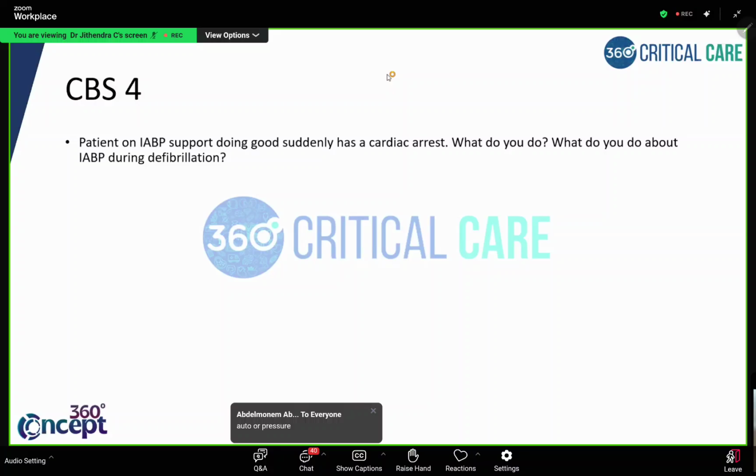So what about the IABP during defibrillation? Should I stop the IABP and defibrillate, or go ahead with defibrillation, or change the current, change the position? Anything about defibrillation? Continue defibrillation, go ahead. So yes, that's the right answer. Go ahead with defibrillation. No need to do anything with the IABP. Leave it like that, and you can go ahead with the regular defibrillation. Absolutely right. I think many of you are answering it also.